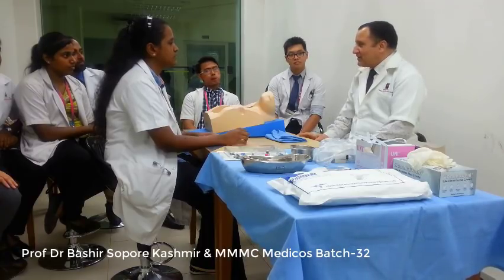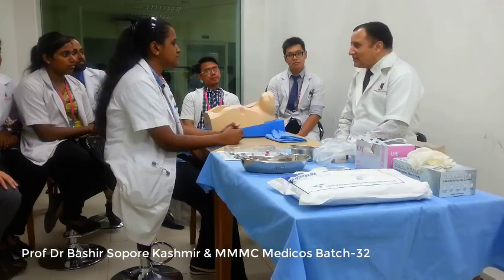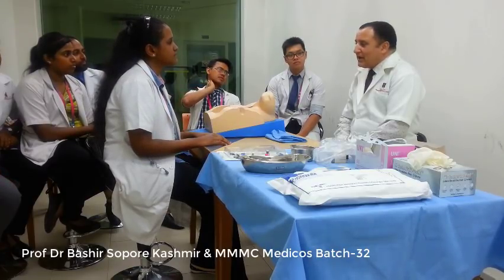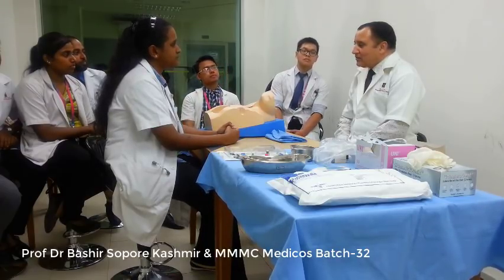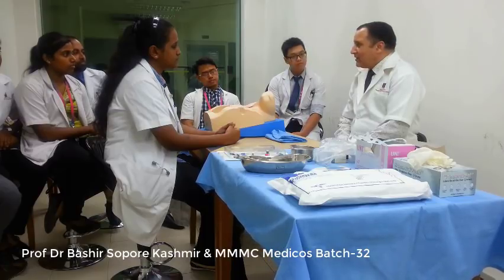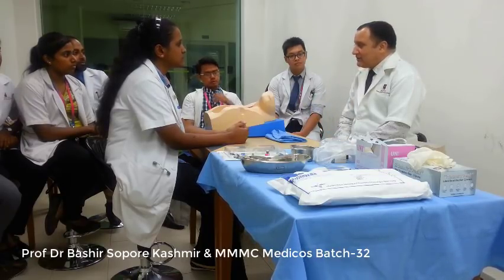The reasons are that this vein has good external landmarks, and there is an improved success when we do this catheterization under ultrasonography, and there is least risk of pneumothorax than subclavian catheterization. And one more thing is that the bleeding here can easily be seen, recognized and controlled.